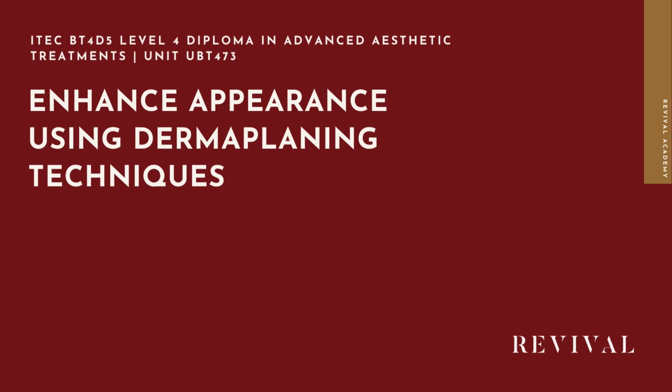Welcome to today's practical training video on the iTEC Level 4 Diploma in Advanced Aesthetic Treatments, and we are going to be focusing on Unit UBT 473, which is in providing dermaplaning treatments. And in this video, we'll go through everything that you need to know about carrying out a dermaplaning treatment, step by step. Now let's get to it.